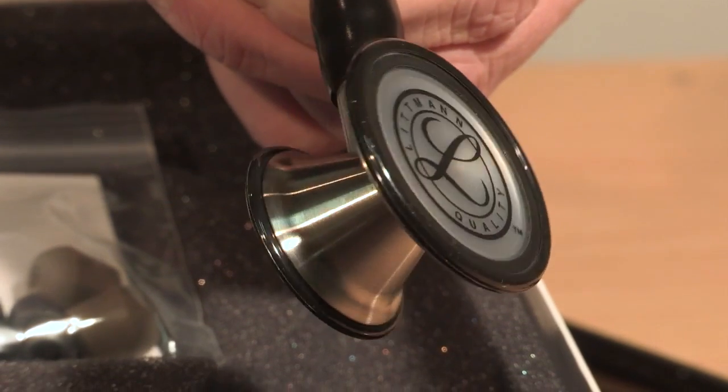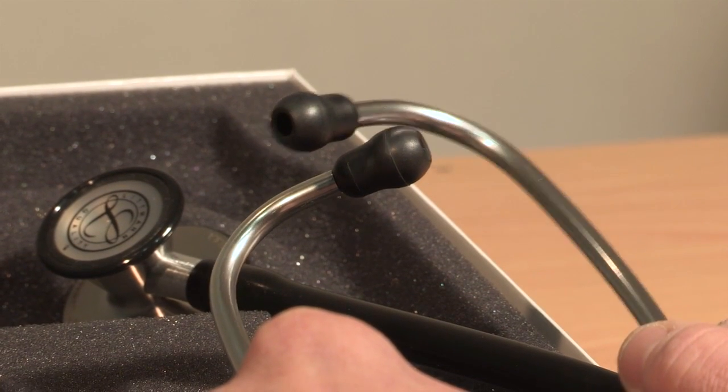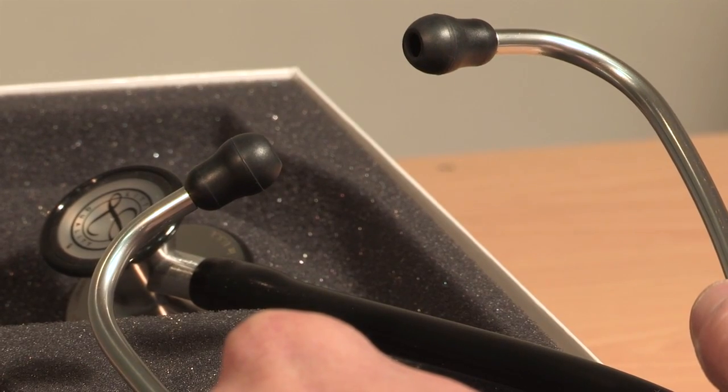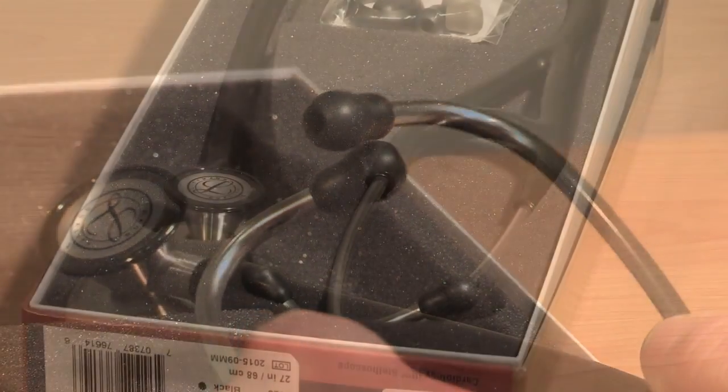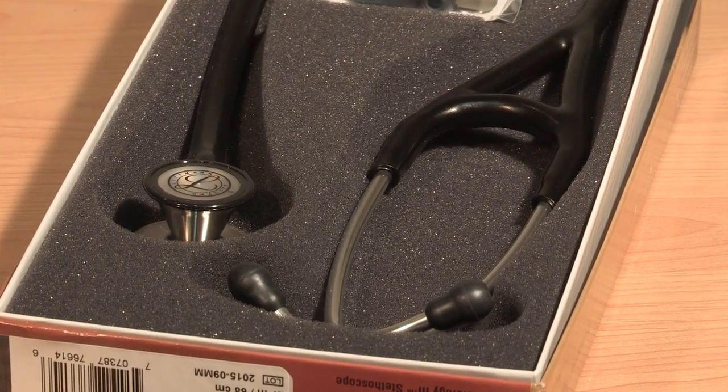It offers an excellent acoustic seal and comfortable fit with patented 3M Littmann snap-tight soft-sealing ear tips. A trusted leader in innovation, 3M Littmann stethoscopes are renowned worldwide for unsurpassed quality.